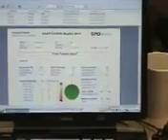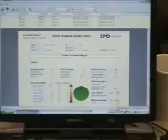That's right. This test showed us the oxygenation was good this night. Does it show his average heart rate and all that? Yeah, his highest pulse rate was 101, and his lowest was 51. His average was 74. Is that normal? Well, it's probably just a little high for a sleeper. You want to see the mid-60s for rest.